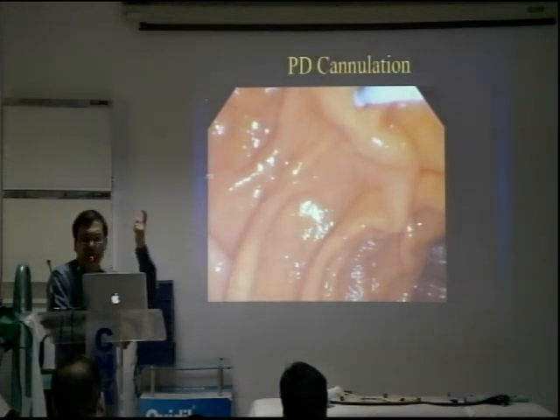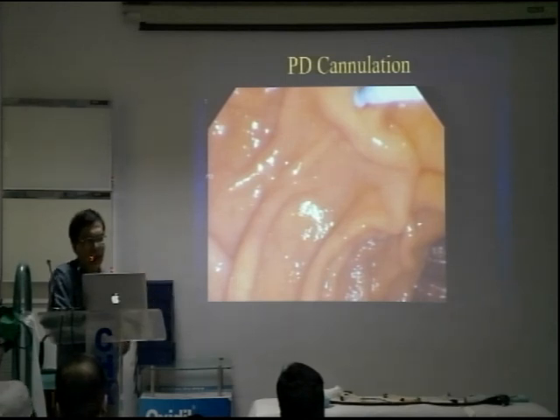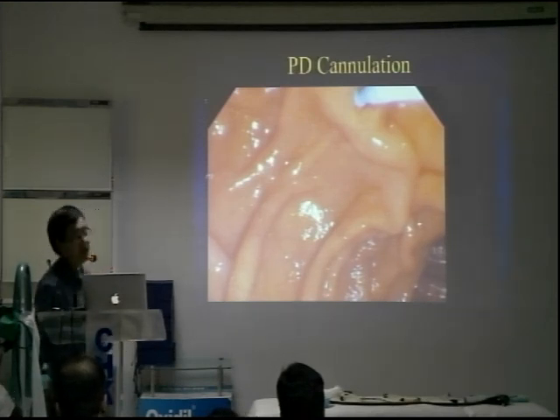Or you can use a Tandem XL. I think you have that, the other regular cannula. I try to avoid the sphincterotome because it's way too big for a smaller pancreatic duct. Here, if you pay attention to the position of the scope, the papilla is this way, right?